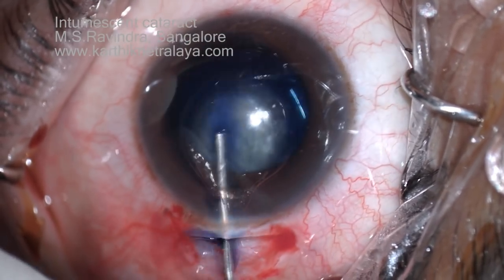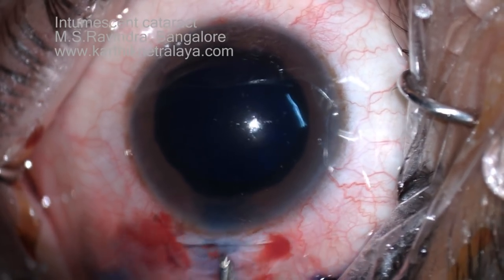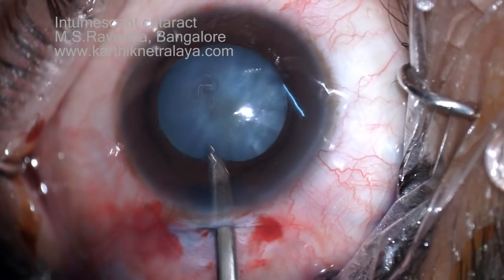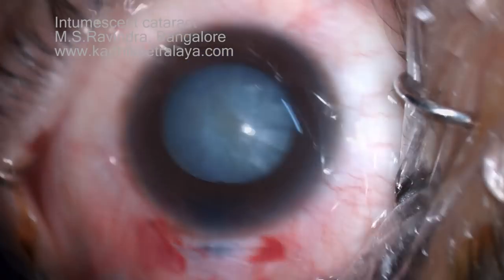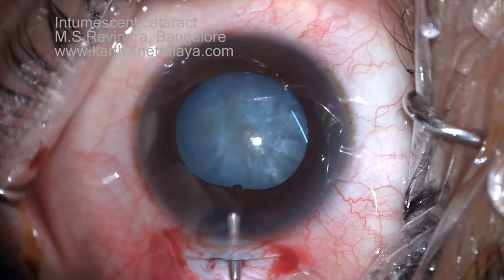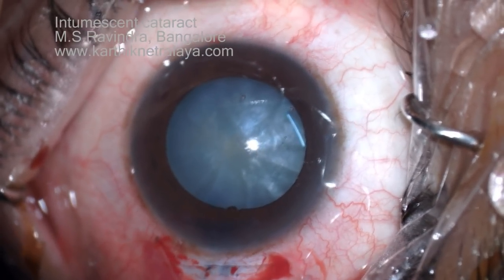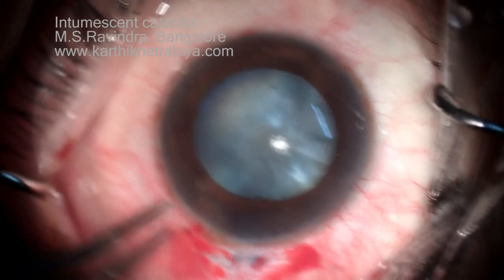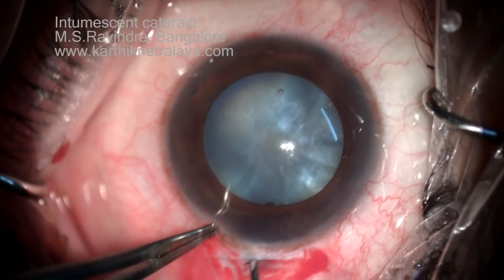It's an intumescent swollen cataract with a hard lens and shallow anterior chamber entry. Trypan blue is applied for a minimum duration — injected and immediately taken out. Ideally it is injected under an air bubble. The anterior chamber is deepened as much as possible so that the entire cataract-zonule diaphragm is pushed backwards.